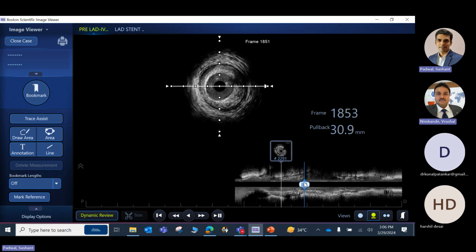Suppose you are referring to IEL to IEL. At some places the hypoechoic appearance of the plaque merges with the IEL, and you won't be able to see the IEL very clearly, right? But the EEL can be very clearly established in contrast to the outer adventitial layer. Clear?